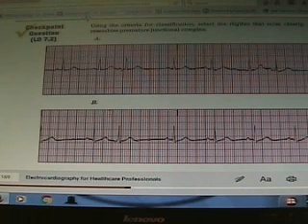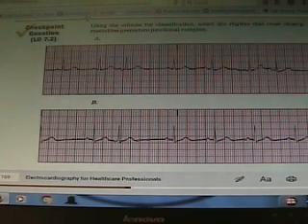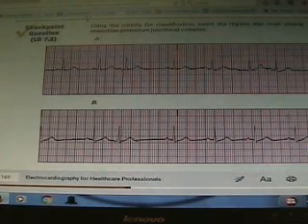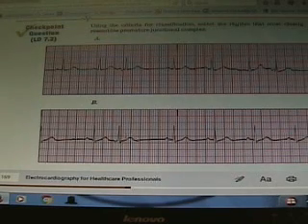Now, on an exam, I'm not going to do this to you. This is evil if I do this to you. This is so mean. But what kind of questions would I ask you? Are all the waves there? I'll show you a trace B. Are all the waves there? And you'll answer no. Which one is the normal one? A. Which one is the abnormal one? A, B, C, or D? And you'll tell me B. I could ask you, what's abnormal about it? It's early. And since it has all the waves, I'll ask you, does that look like tachycardia, bradycardia, premature junctional, or none? That's how I would ask it.